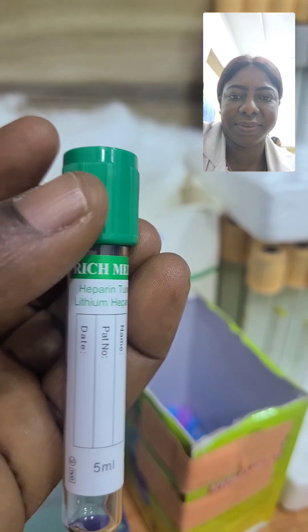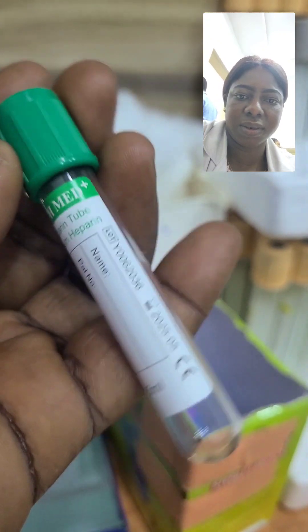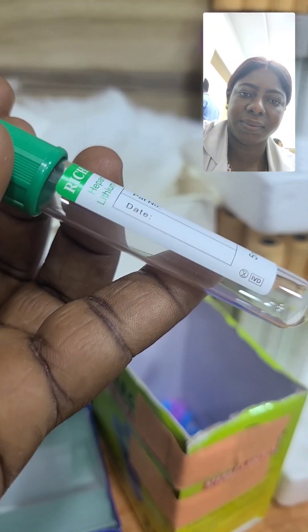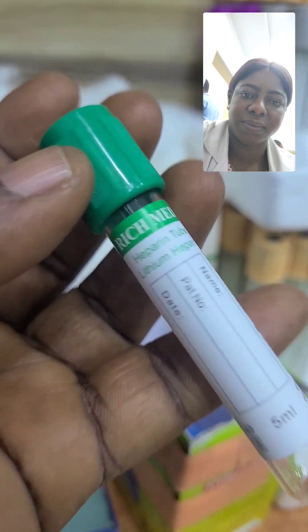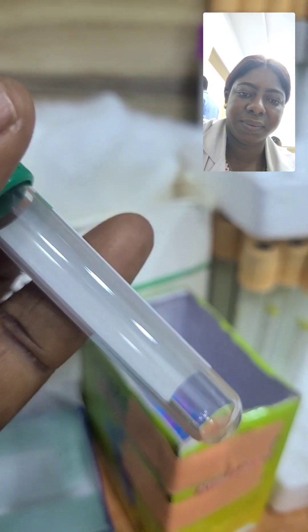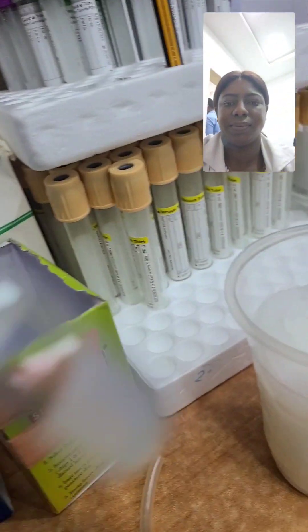Here is another bottle — the green cup, the lithium heparin bottle. Here where I work, we normally use it to collect bilirubin samples; that is what we use it for mostly.